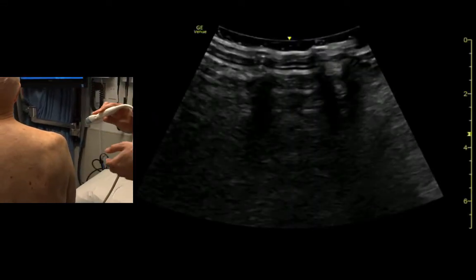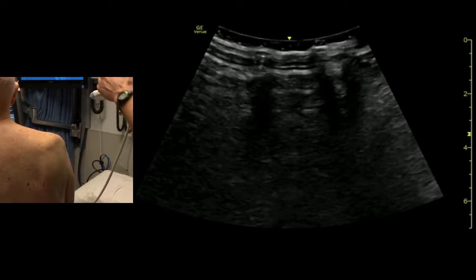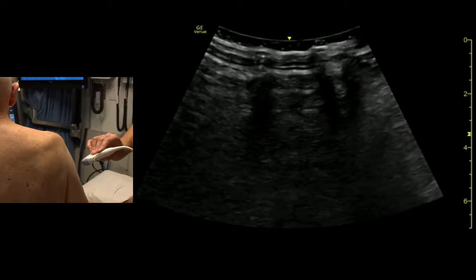This is a glenohumeral joint. We'll look at this if a shoulder is dislocated or if we want to inject the shoulder. Once we get behind the patient, we try to orient our indicator with where it is on the screen. The indicator is to our left, so we're going to keep it to our left to identify the glenohumeral joint.